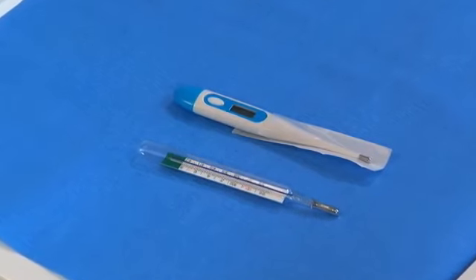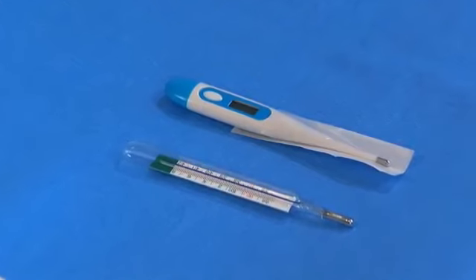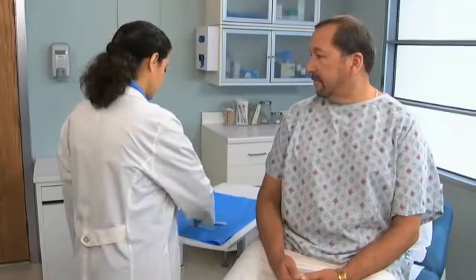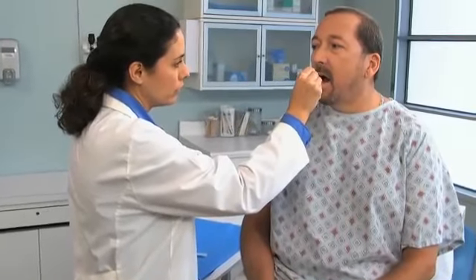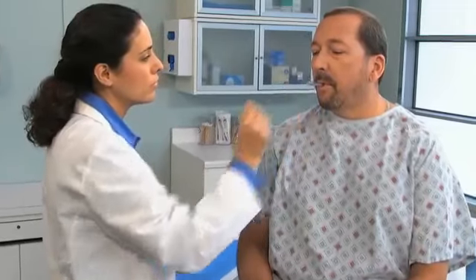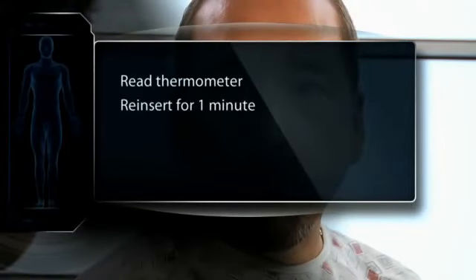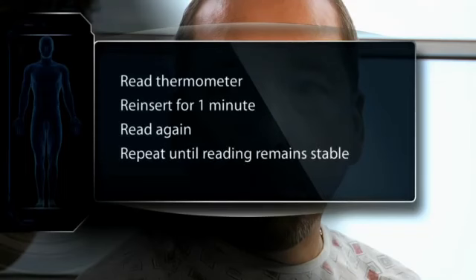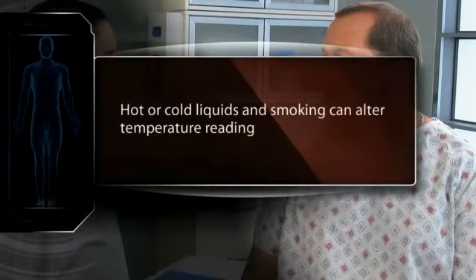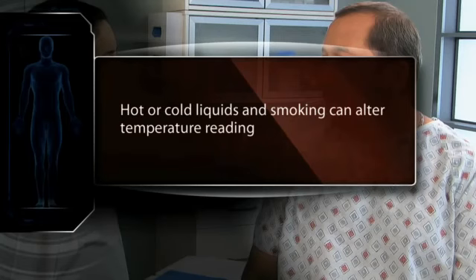For oral temperatures, choose either a glass or electronic thermometer. When using a glass thermometer, shake it down to 35 degrees Celsius (96°F) or below, then insert it under the tongue, instruct the patient to close both lips, and wait three to five minutes. Read the thermometer, reinsert it for one minute, and read again; if the temperature continues to rise, repeat until stable. Note that hot or cold liquids or smoking can alter the reading, so delay measuring temperature for 10 to 15 minutes in these cases.